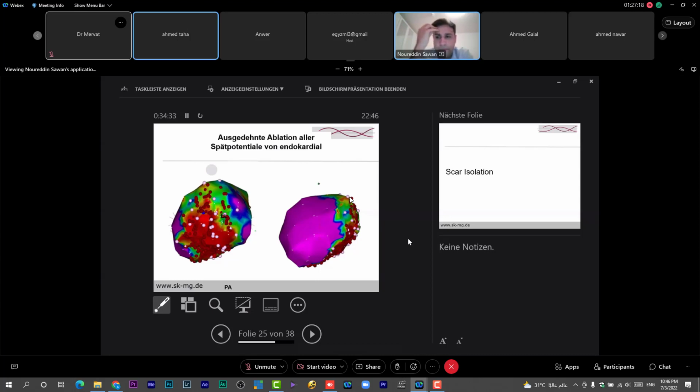Just one comment for the pace mapping, for example, the base mapping. As I said before, even if you got, for example, 12 by 12 ECG and sometimes 11 by 12, I have 3 other integrated points: the stimulus to QRS complex compared to the local EGM to the QRS complex. And the second important thing, if you are doing it, for example, in the isthmus zone or inner loop or something, it can sometimes give a morphology difference.